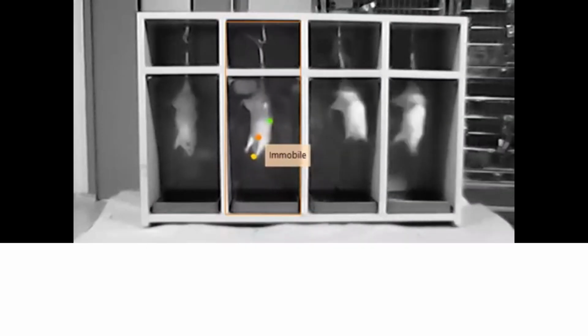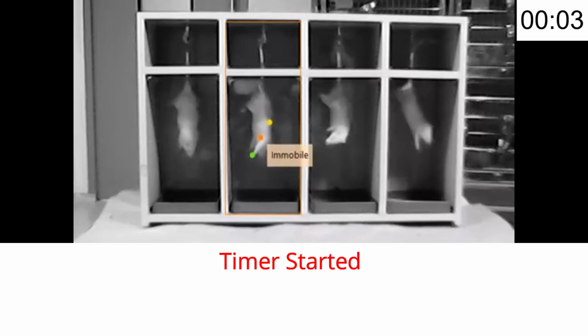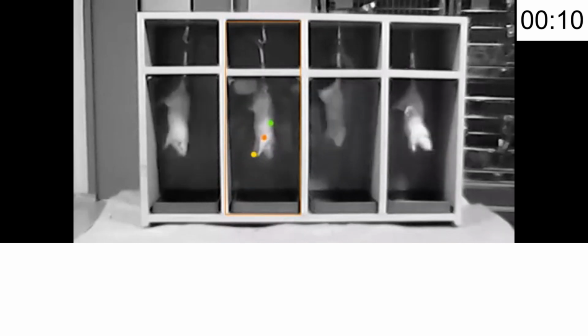So here is how the test is performed. First, place a healthy mouse or rat inside the chamber. Attach the tail gently. Tape the tail near its tip and secure it to the suspension. Suspend and observe. The animal is suspended in the air, unable to reach the wall or floor. Its struggle and immobility are recorded for about 6 minutes.